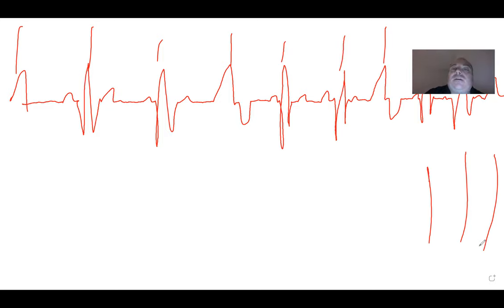So we talked about PVCs. We talked about unifocal, multifocal. We talked about runs of VTAC, couplets, okay? Don't confuse couplets and bigeminy. And we talked about trigeminy. So that's pretty much it for that, okay? So let's go back to the PowerPoint.